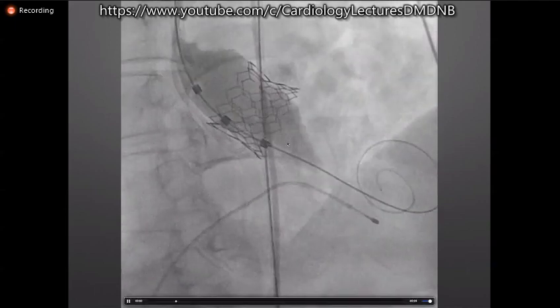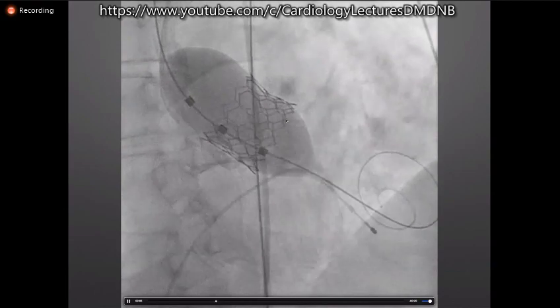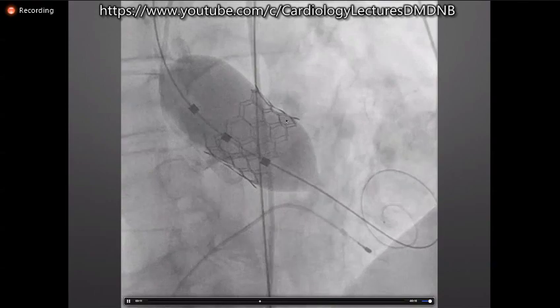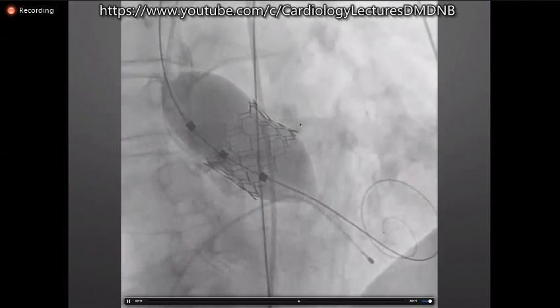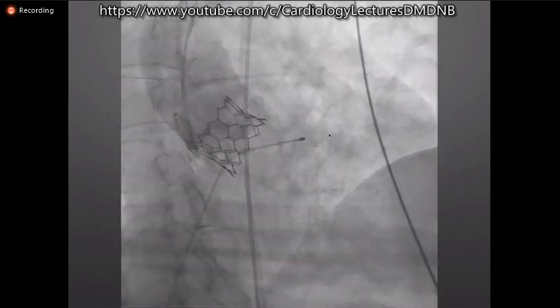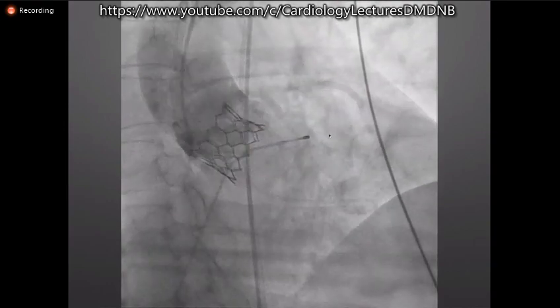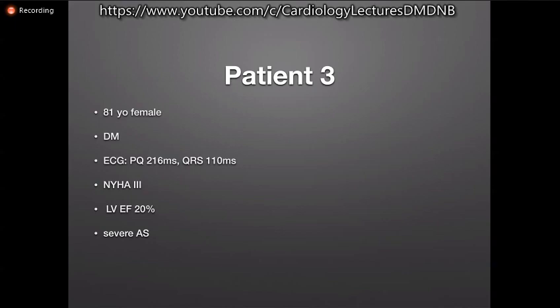When we implanted the valve, we saw that there is indentation on the left coronary cusp side. So we thought we will post dilate with the same balloon. And this changed the situation a little bit. We did the angiogram later on. As you can see here, there is no regurg, no residual stenosis. So one more patient done.